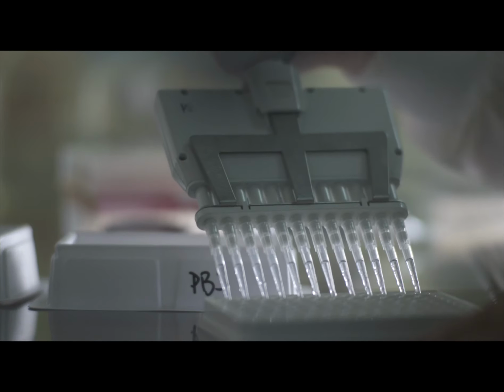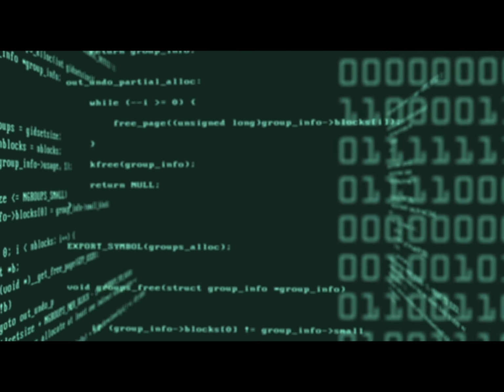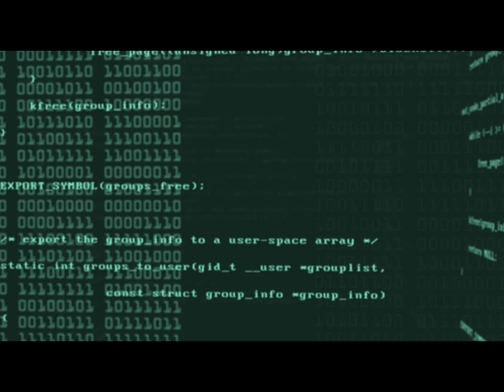Do you use the GeoMx digital spatial profiler to measure spatial expression in your tissue samples? Are you overwhelmed when it comes to analyzing the data or applying the numerous computational tools that exist for spatial datasets? Do you want to spend less time coding and more time interpreting your results? Then GeoMx Cloud is the solution for you.